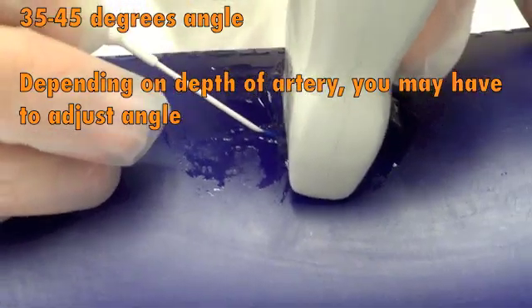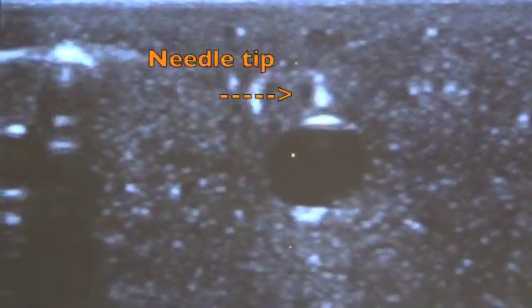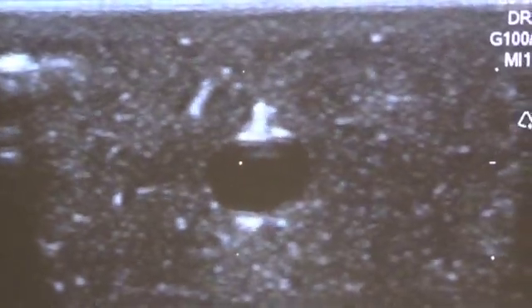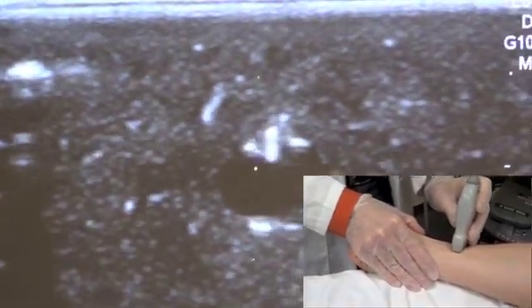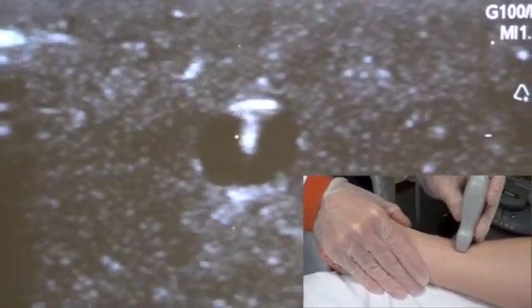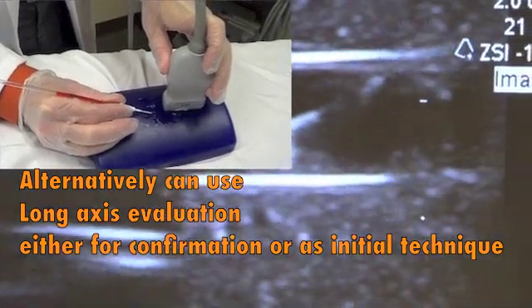I've submerged the tip of the needle under the skin and will locate it with the ultrasound probe by sliding the probe distally until I've located my needle — and there it is, there's the tip. I advance the needle until it's cannulated the artery, following it the entire time by sliding my ultrasound probe cephalad, or proximal, to the patient. You can see that the tip of the needle has cannulated the artery, with the cannula abutting the posterior wall of the radial artery.